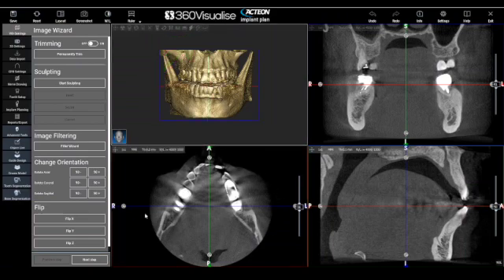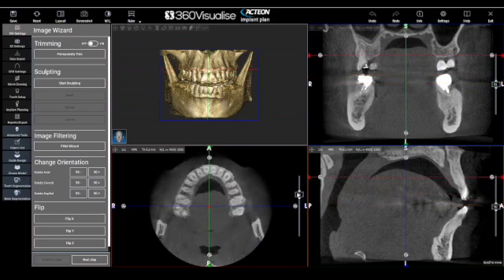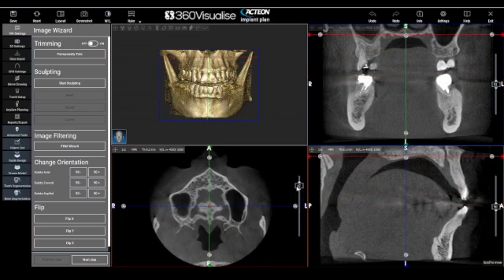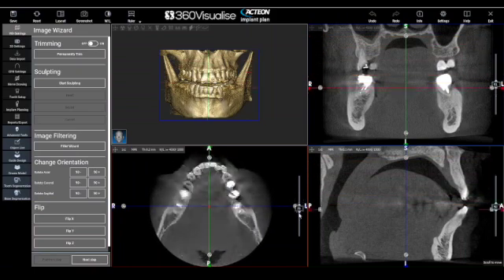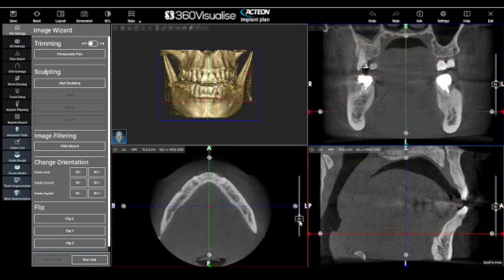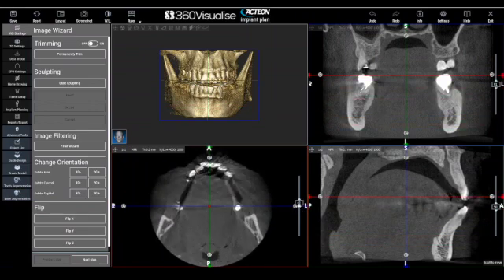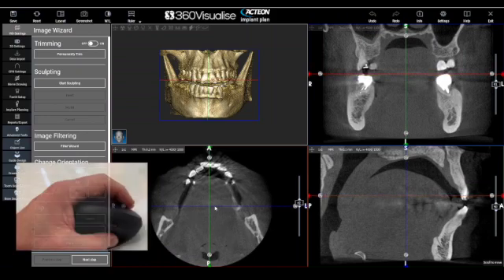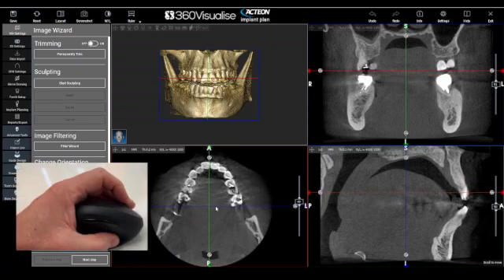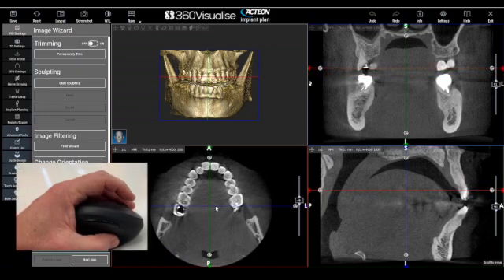This is the axial view, marked by the red line. We can move through the slices by dragging this slider up and down. As we do this, you can see the red line moves on the other views. We can also hover over the view and roll the mouse wheel forward and backwards to slowly go through slice by slice.